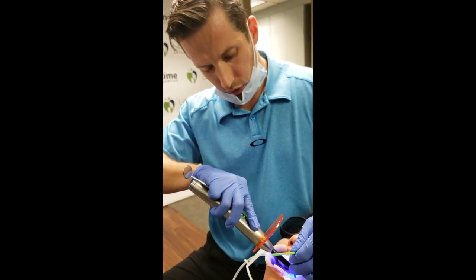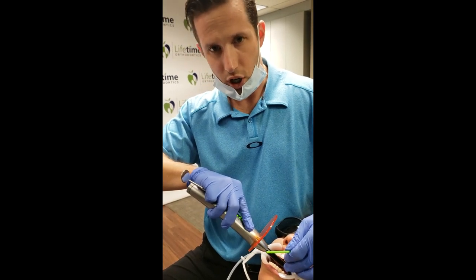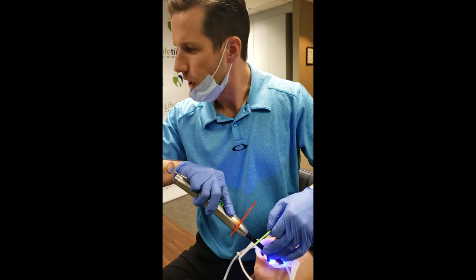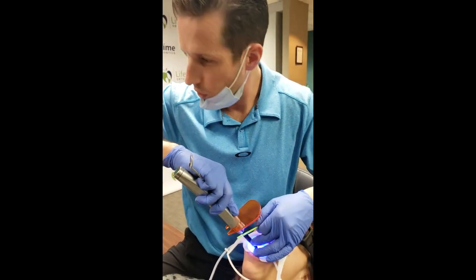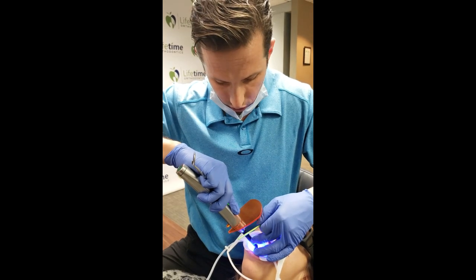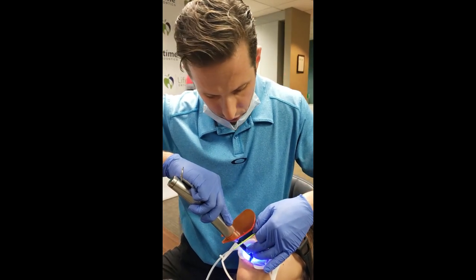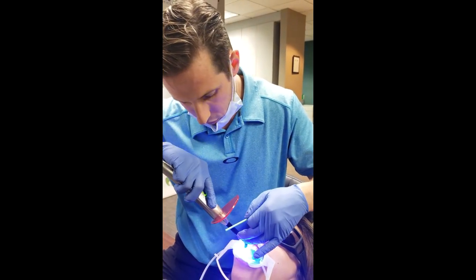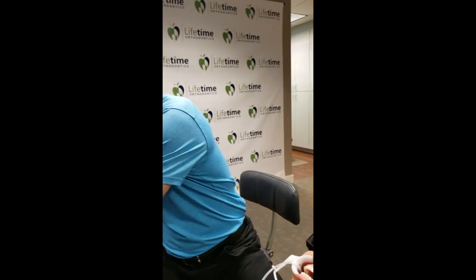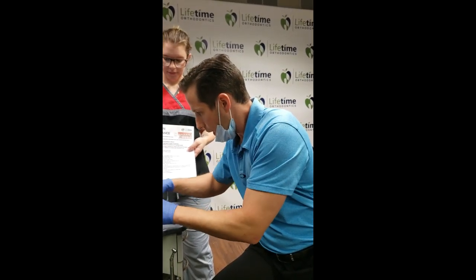The most important thing beyond good bonding is the instructions. We want to make sure patients are going to wear this full time. They never wear the elastics without the retainer. I'm going to show you the retainer - I don't believe we cut out spaces for the buttons just yet, so we'll have to get the hole punch and do that. If they're wearing Invisalign, there are probably already pre-cut hooks; we put the aligners on and line that up. If we made a retainer, we cut them out here.